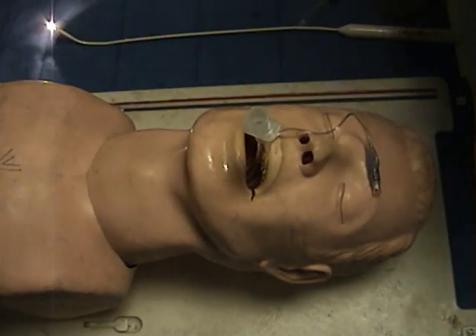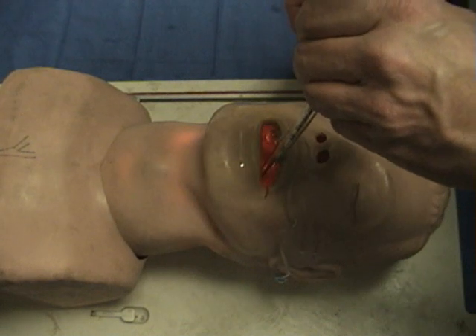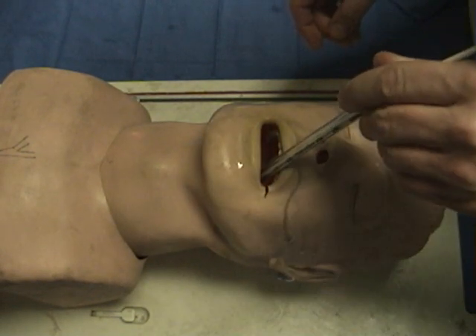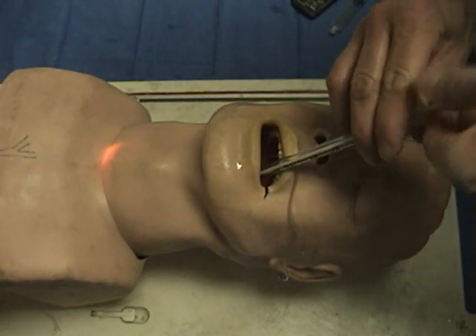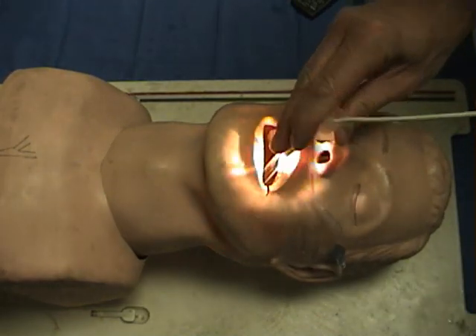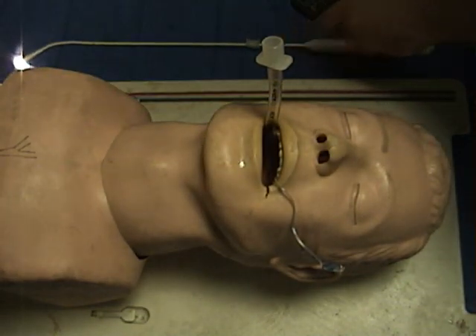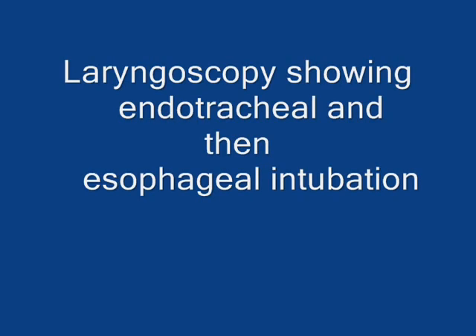We are now going to demonstrate what a failed esophageal intubation with the lighted wand looks like. Notice that as we transilluminate, we lose transillumination — that is a key element. We should always maintain transillumination to the neck; sometimes it can appear in the lower neck or suprasternal area. A loss of transillumination is a sign that the tube is not in the proper tracheal position.